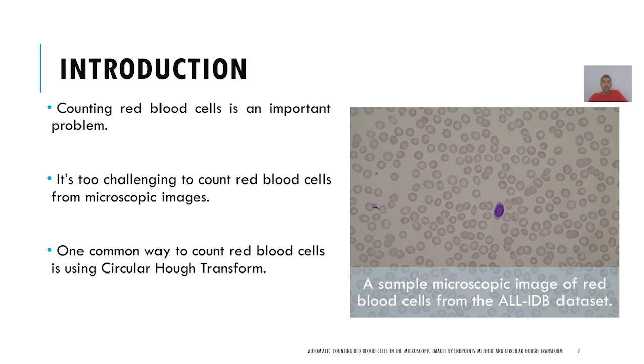The automated method is done with various machine learning techniques and image processing. It is performed with the assistance of a microscopic image of the person's blood and a computer system.